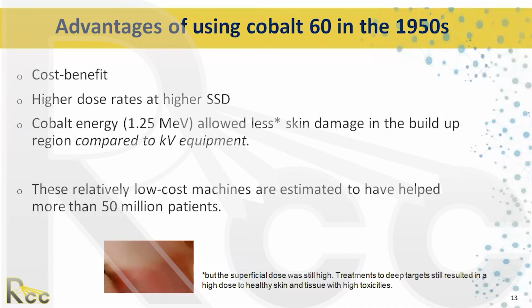So the doctors that delivered these X-ray therapies at low energies had to be very careful of bone dose if bone was in the field, because at low energy, bone can absorb 2 to 3 times as much as tissue. But at high energy, bone and tissue absorb about the same amount of dose. So there is less heterogeneity and more homogeneity in the dose surrounding bone.